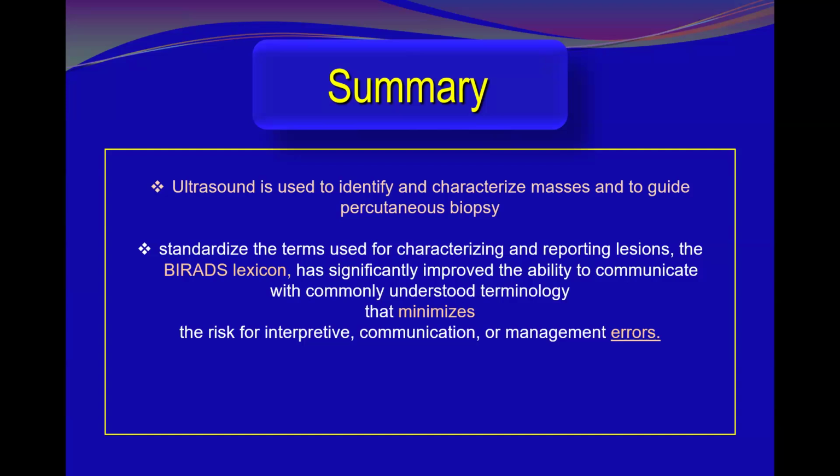The BI-RADS lexicon has significantly improved communication with commonly understood terminology that minimizes the risk of interpretive, communication or management errors.